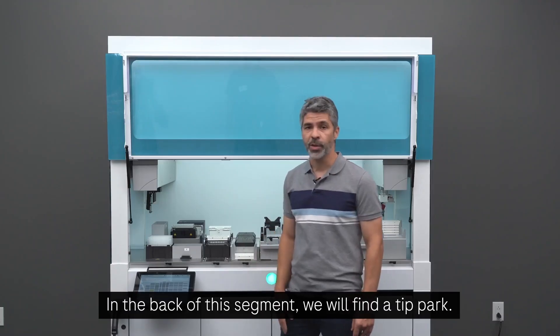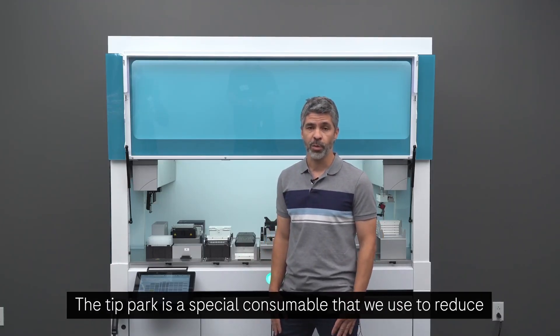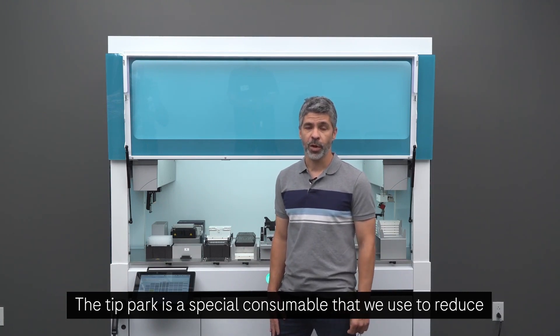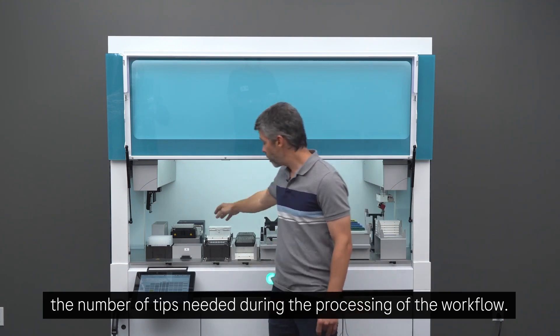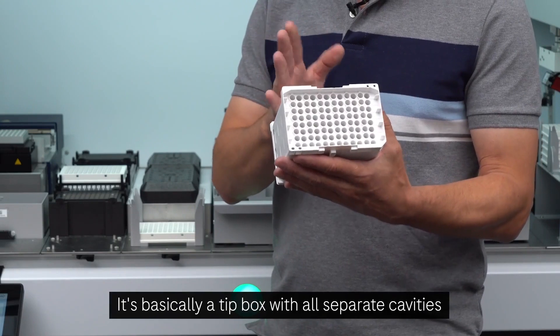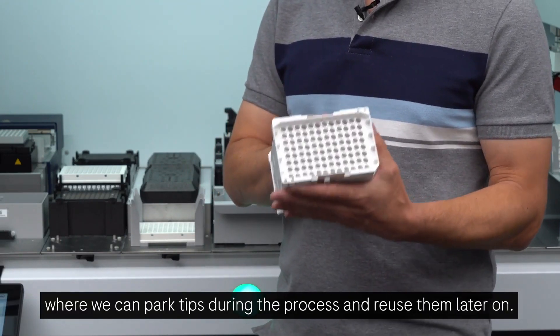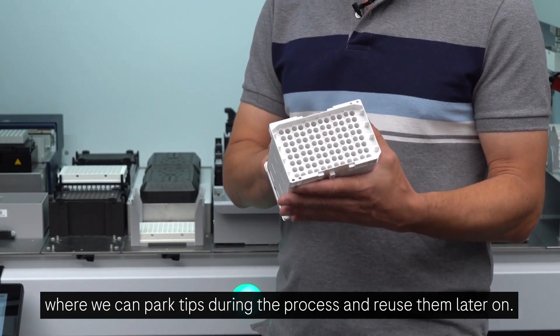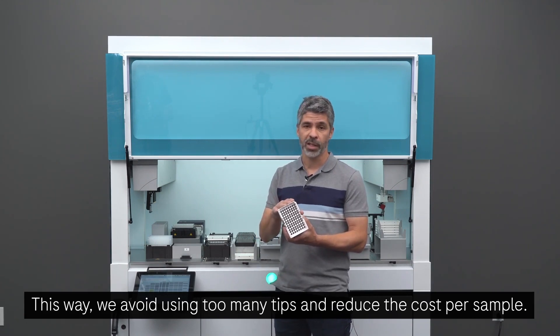In the back of this segment, we will find the tip park. The tip park is a special consumable that we use to reduce the number of tips needed during the processing of the workflow. It's basically a tip box with all separate cavities where we can park tips during the process and reuse them later on. This way, we avoid using too many tips and reduce the cost per sample.